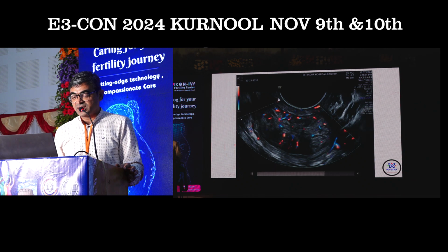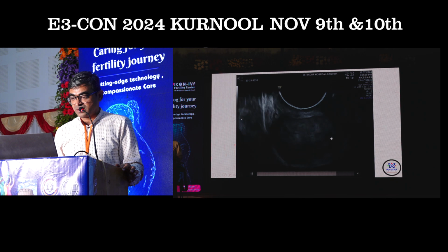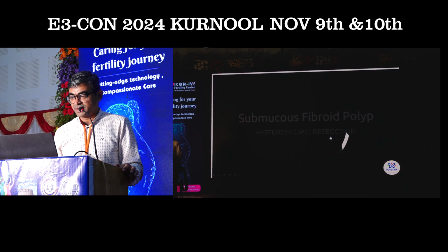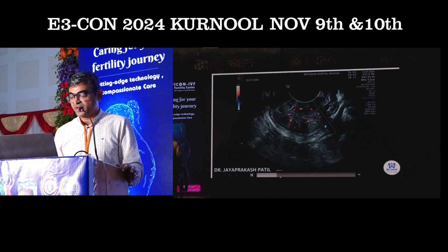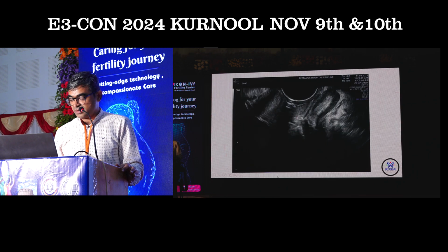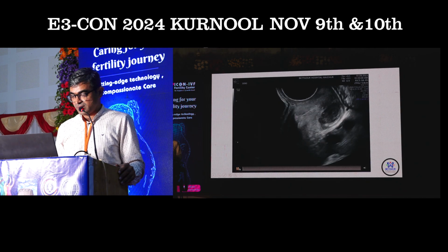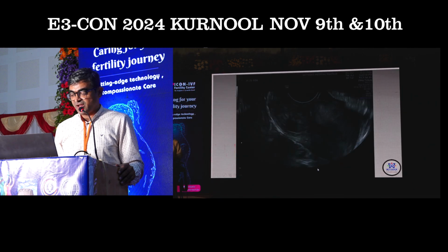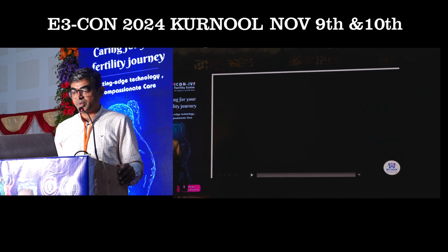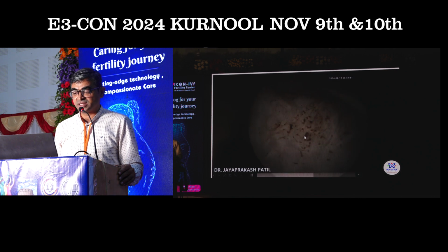So the same case, you are able to appreciate. The surgeon will come to know, okay, now I have a cervical fibroid. We already mapped that. So in endoscopy, you are able to appreciate that we are having hindrances to reach the upper corpus. So we resect this using the resectoscope. Then we later go into the corpus to see from where exactly the stalk is coming from.